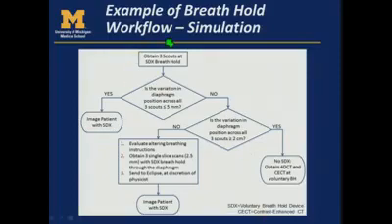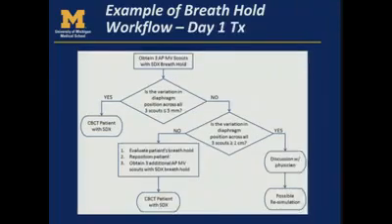And so what we do for our breath hold simulation is we'll acquire 3 scans to look at the reproducibility of a breath hold. And if a patient isn't able to have a reproducible breath hold for treatment planning, we may decide to treat them free breathing, or we may decide to employ some additional breathing instructions for that patient. And then, of course, we do a very similar process on the first day of treatment.